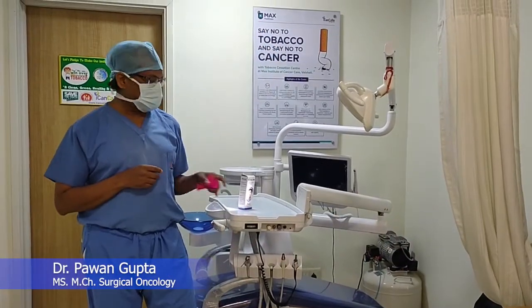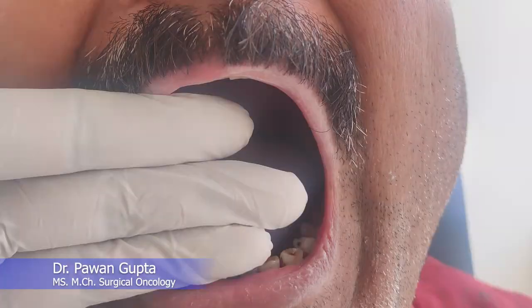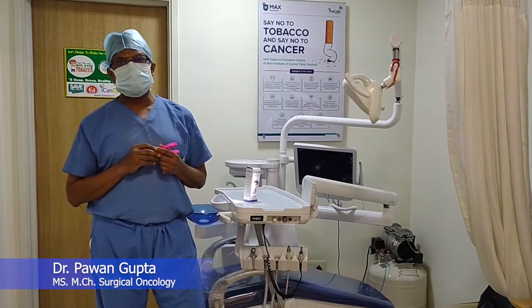Hello friends, today we will learn about how we measure mouth opening when the mouth is closed. How do we do the grading?